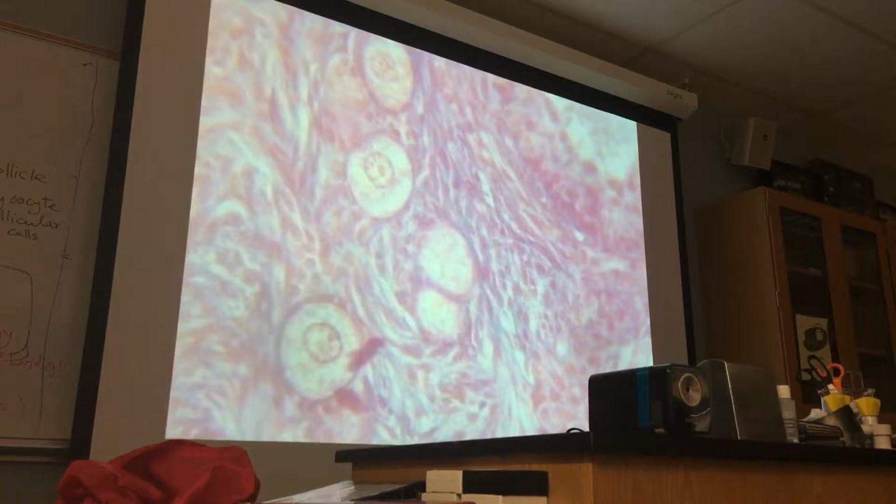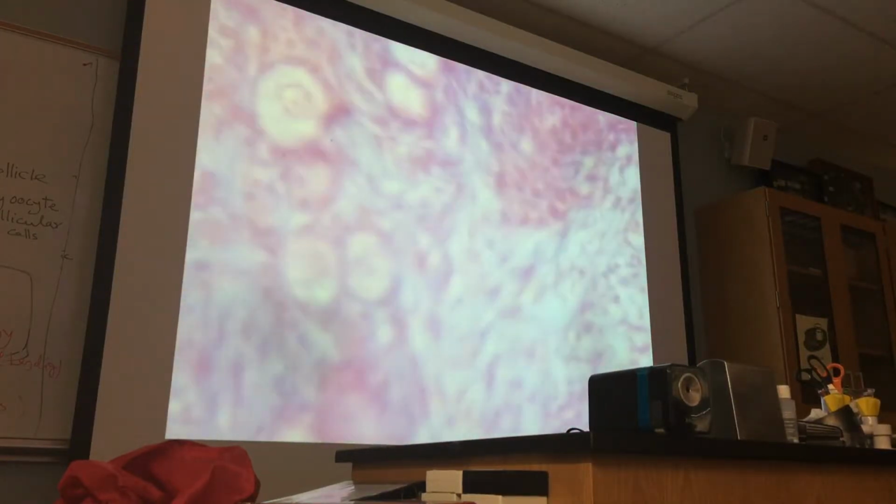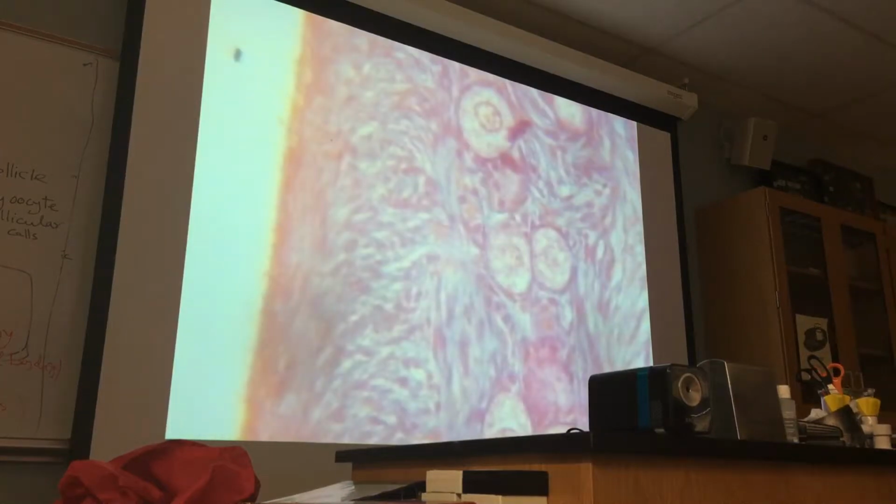And then are those collagens? There are collagen fibers. You don't have to worry about that. Yeah, there are collagen fibers. Don't have to worry. This is a primordial follicle. These are all primordial follicles.